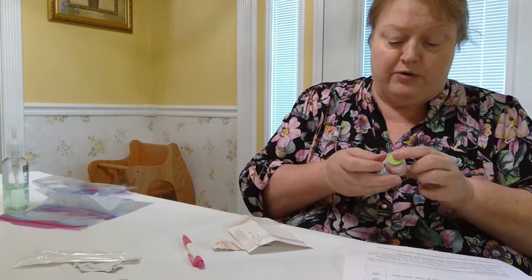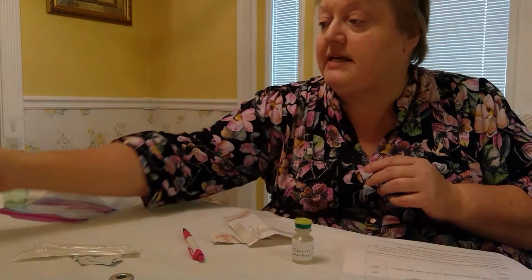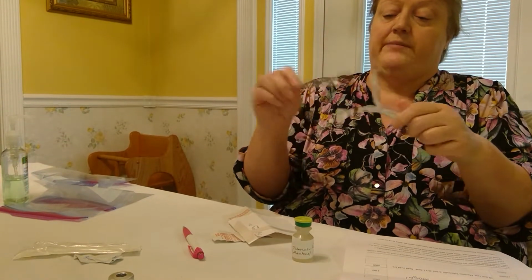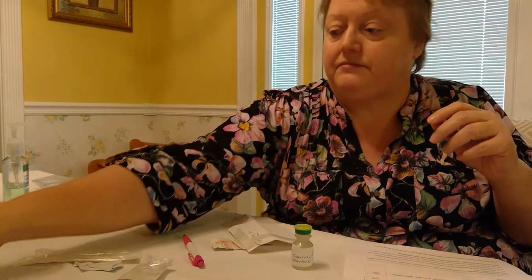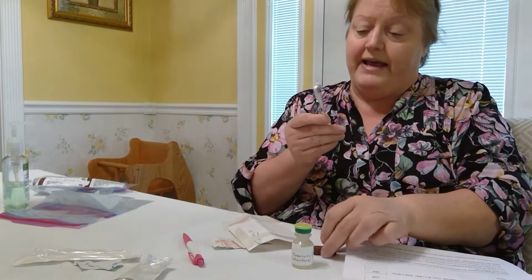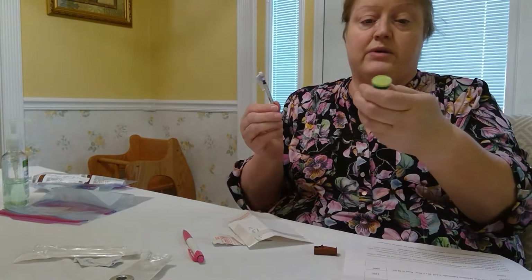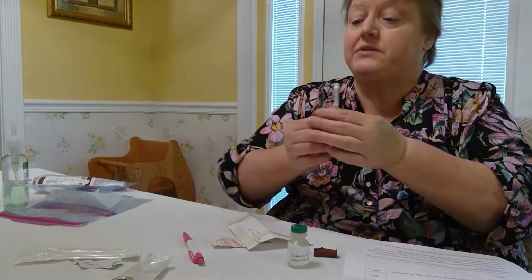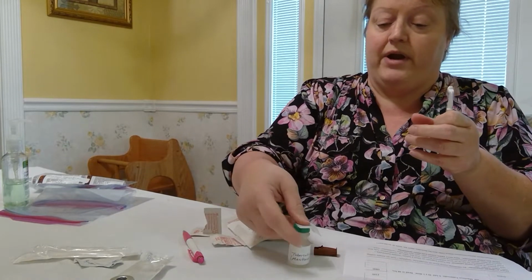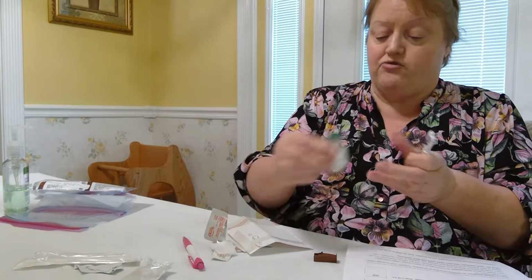Last, we're going to do our TB skin test. We're going to need to get our TB skin test or TB syringe. We're going to need to pull up that amount, 0.1. This one has a new cap. I'm going to pop it off, but I am still going to clean it with a brand new alcohol swab, even though it's a brand new bottle. Allow that to dry.